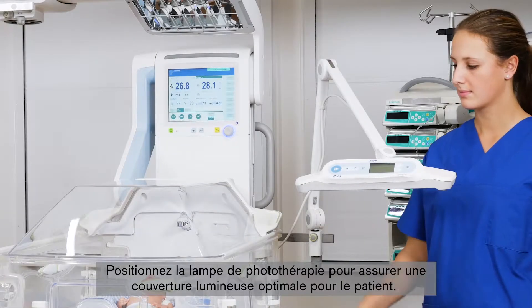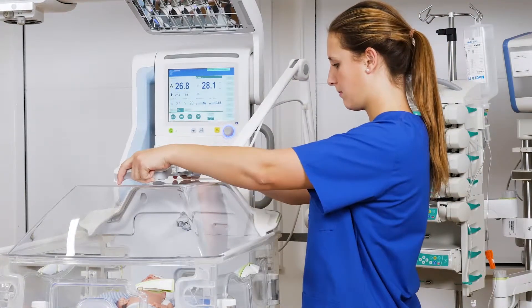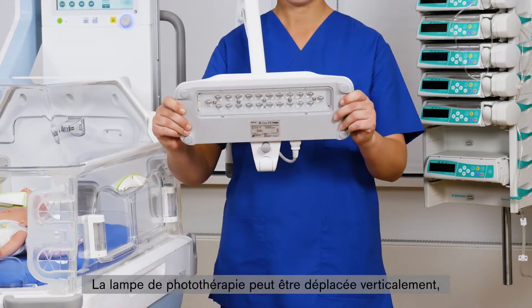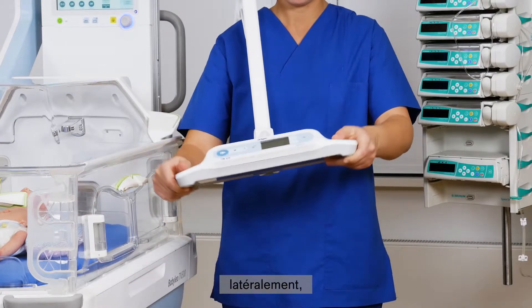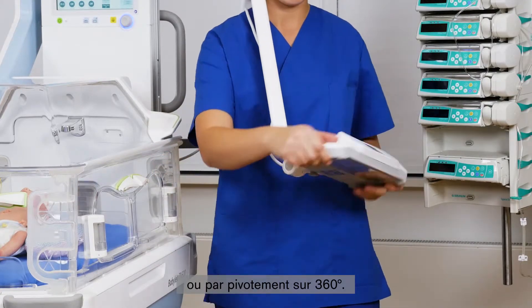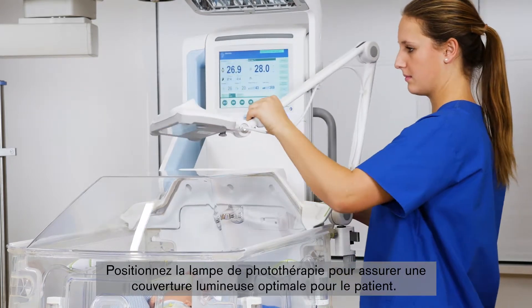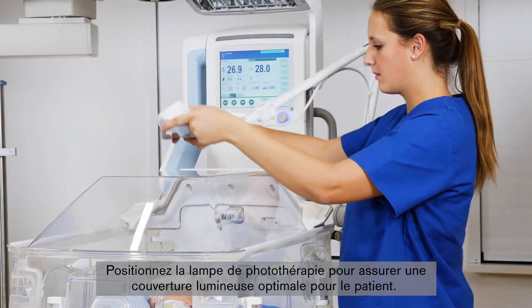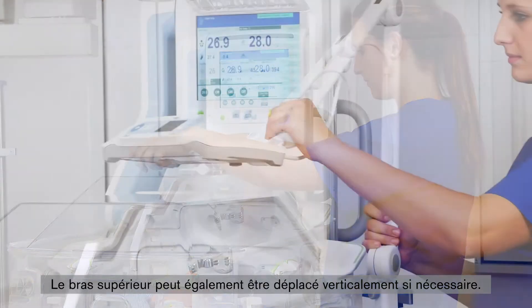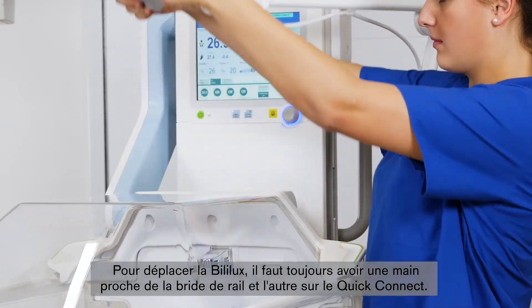Adjust the phototherapy light to a position that will provide the optimum light coverage to the patient. The phototherapy light can be moved up or down, side to side, or swiveled 360 degrees. You can move the bottom arm in the horizontal direction to bring the Bililux closer or further away from the warming therapy device, and you can also move the top arm up or down as needed. To move the Bililux, you should always have one hand close to the rail clamp and the other holding the Quick Connect.